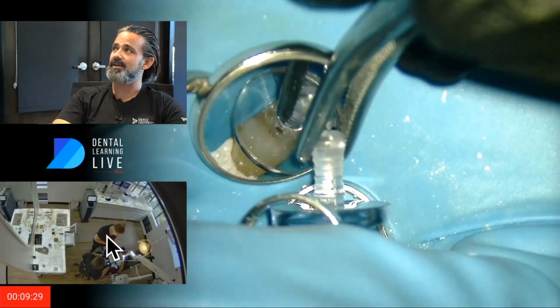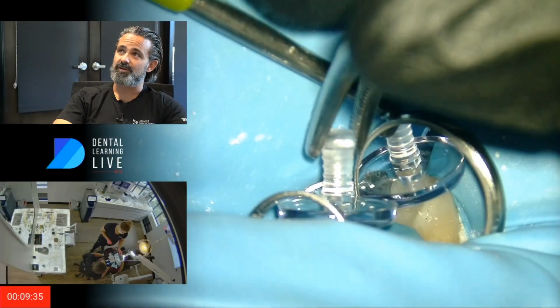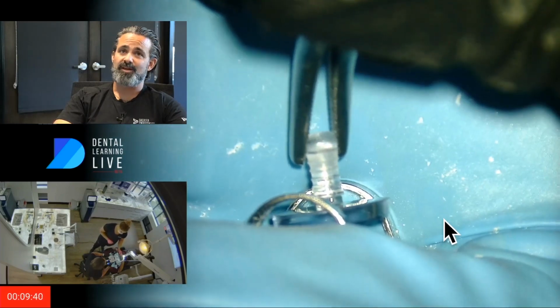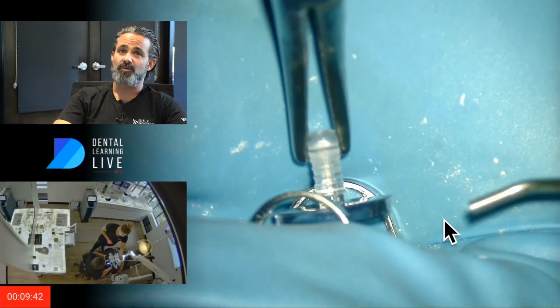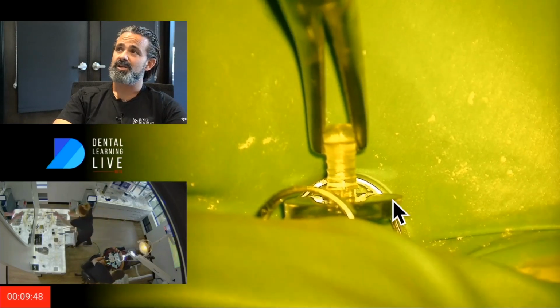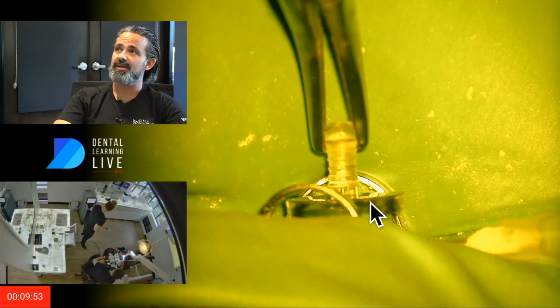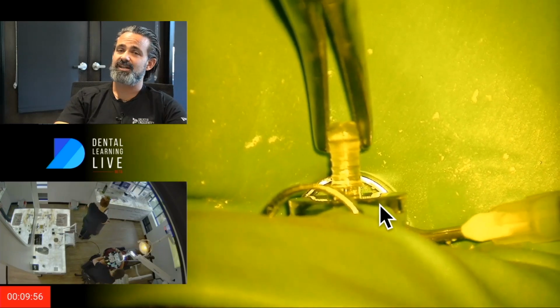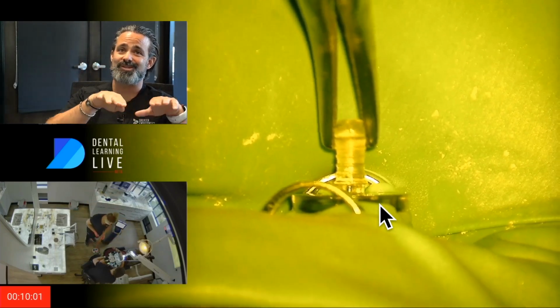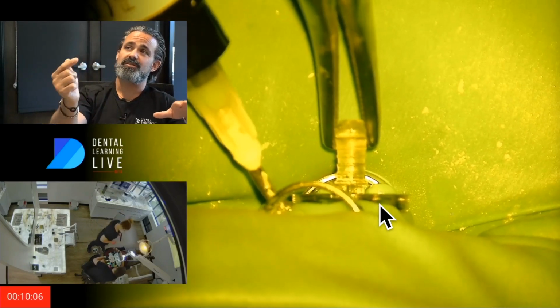So that matrix is sticking up pretty high. If you look around that, it's several millimeters up above. It's just barely going in the access, and that's what I wanted to do. I didn't want to open that up so that platform touched cusps. And so what I'm doing is I'm taking the sound seal, and I'm going to come in using both my hands here. And I'm just injecting up on the platform because the platform is really smooth and it spreads the sound seal around bubble free. And then I'm going to try to do that left-handed now.